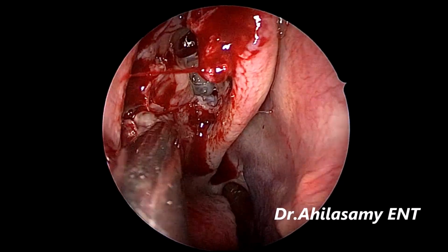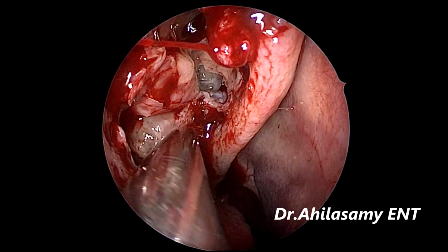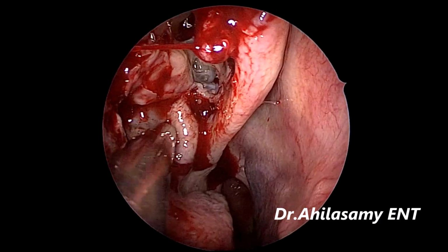Now I am using the shaver again to widen the middle meatal antrostomy.